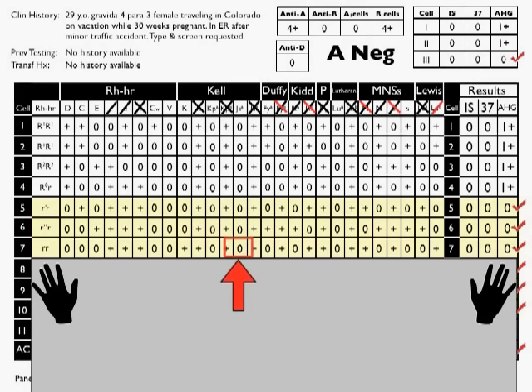Now this brings us to a great topic of discussion right here. We've already ruled out little k, so there's nothing more to do with that. The one exception to that double dose or homozygous rule out thing that I mentioned earlier, for me, is anti-big K. And most immunohematologists will do this as well. In the setting of cell 7, where you have big K present along with little k, so admittedly, that is a single dose of big K, and anti-big K can show some dosage. Nonetheless, the vast majority of people will do a single diagonal slash in that setting, and that is really about the only exception. And I think that that's an acceptable practice.